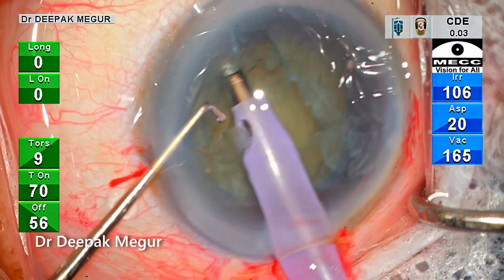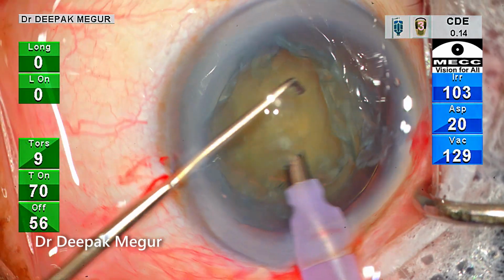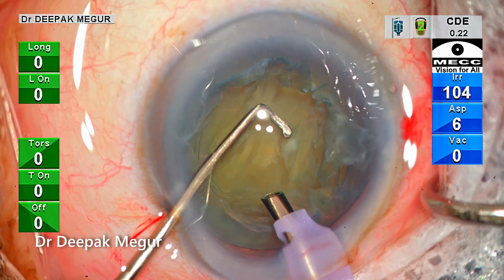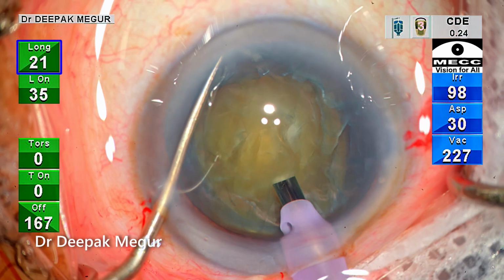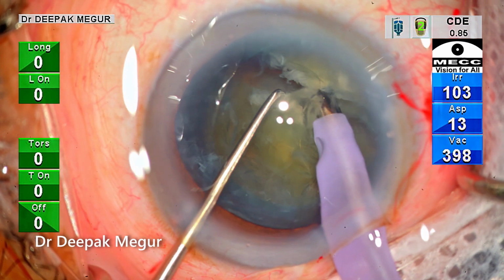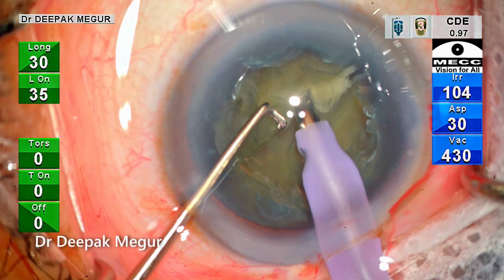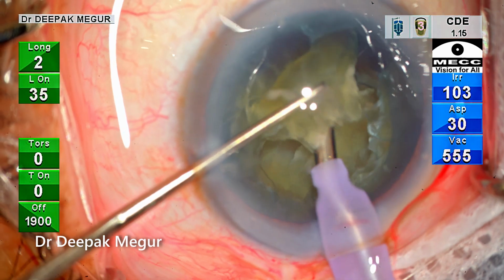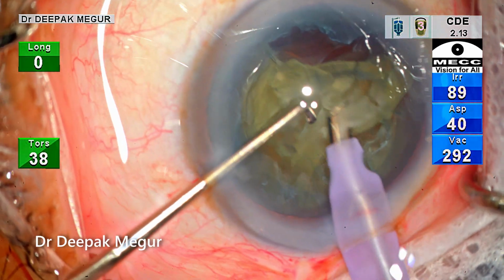The initial epinucleus is just being aspirated. The settings are changed to chop mode where only longitudinal energy is used. The phaco tip is buried into it and the chopper has gone in and hooked the equator of the nucleus, and both the instruments move towards each other. The first chop is initiated. You can see the chopper goes under the capsule and then hooks the equator of the nucleus. The first piece is pulled out of the bag and then emulsified at the level of the pupil.